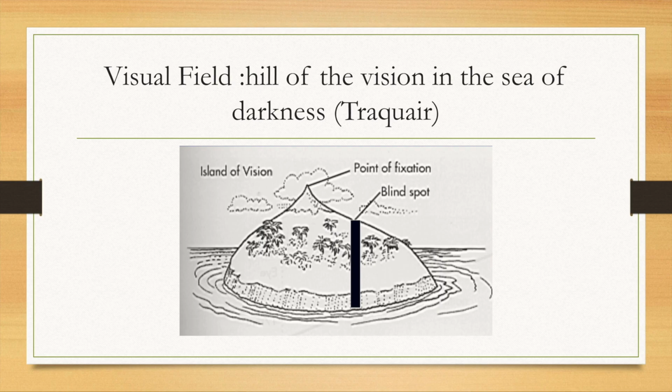The sharpest point is the point of fixation, where the sensitivity is high and you need a lower intensity stimulus to stimulate this point. And you can see also the blind spot, which is in the temporal part.